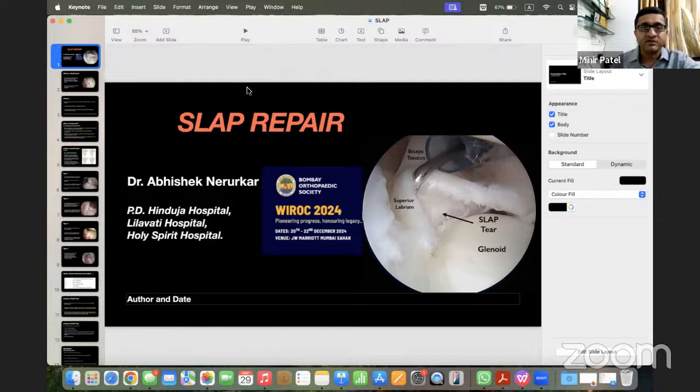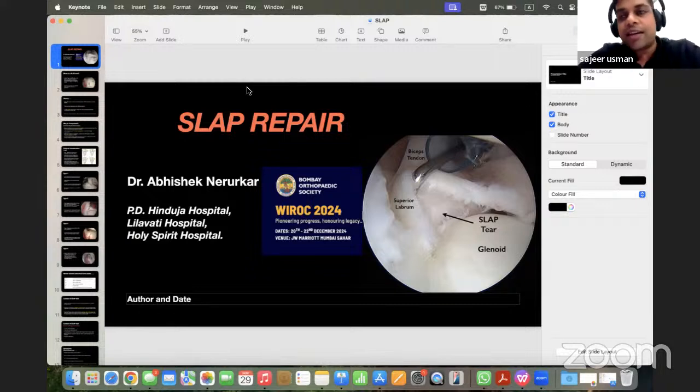Sajid, what's your choice? You're doing a Bankart tomorrow morning. Which anchor do you have ready? I somehow started liking the all suture anchors, but I'm also closely observing the incidence of subchondral cyst, which many people are reporting with the use of these anchors. I'm not sure how much experience I have to say about cyst formation, because these anchors are fairly new. We really need to observe, but it makes very small holes on the face of the glenoid, so taking off less articular cartilage.